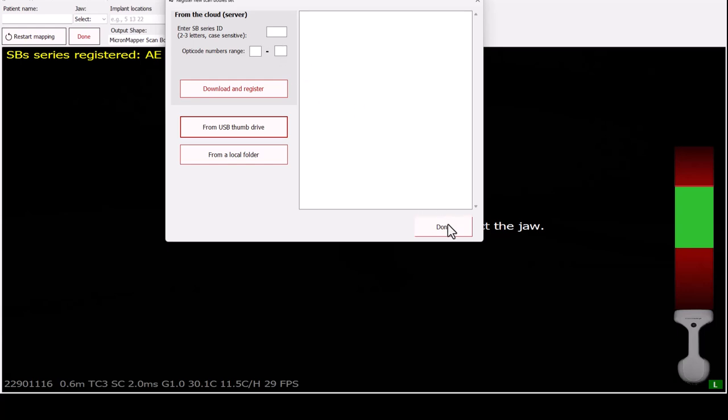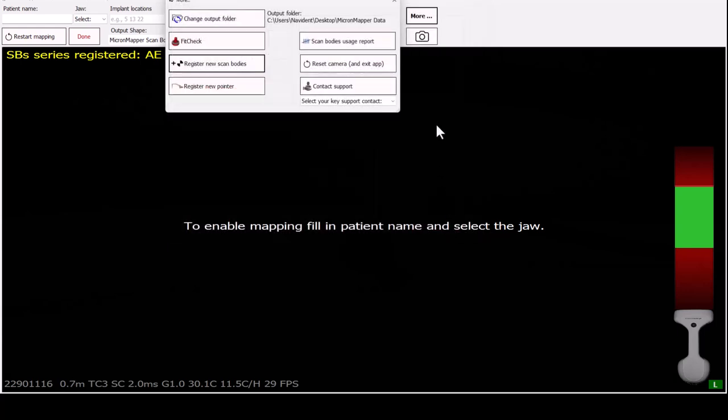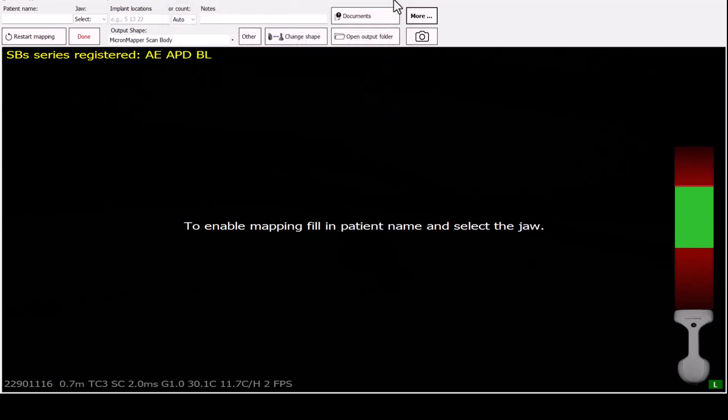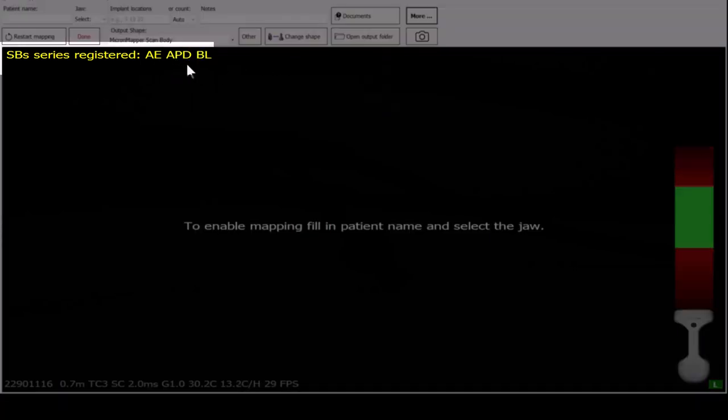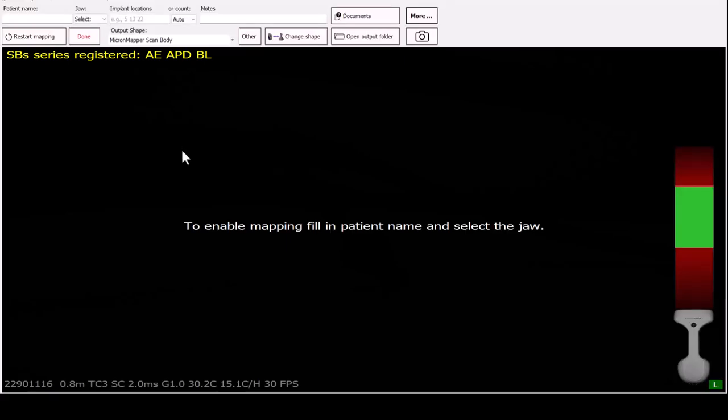In the main screen, verify that your scan body series registered corresponds to the ones you have. In the example shown, I do have APD series, which are displayed.